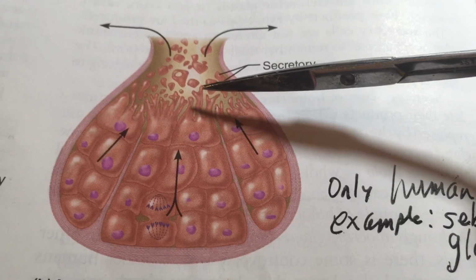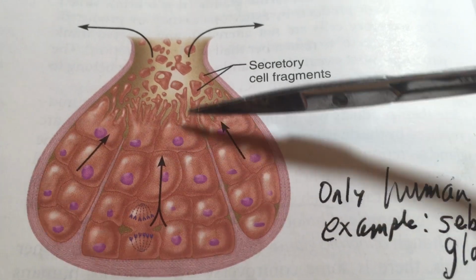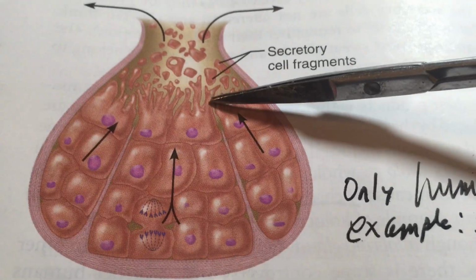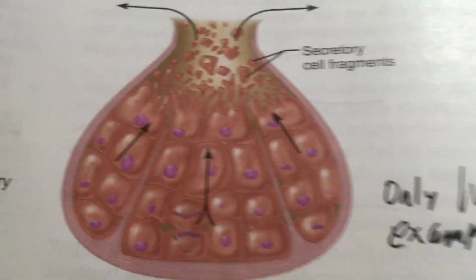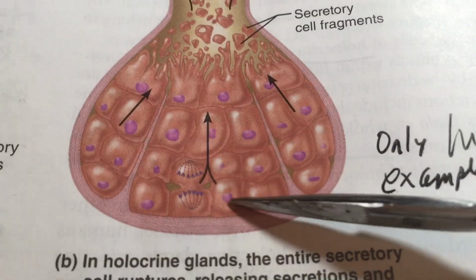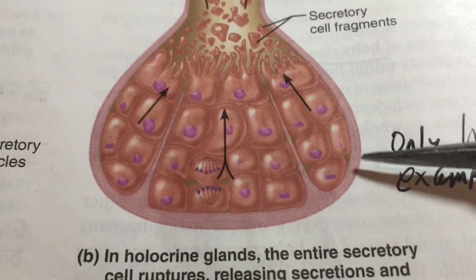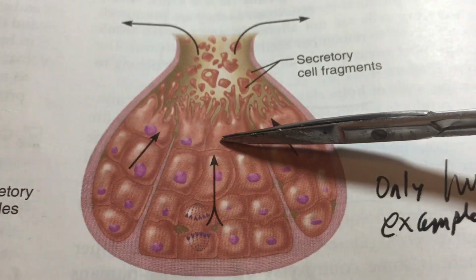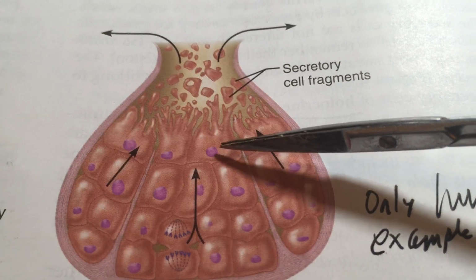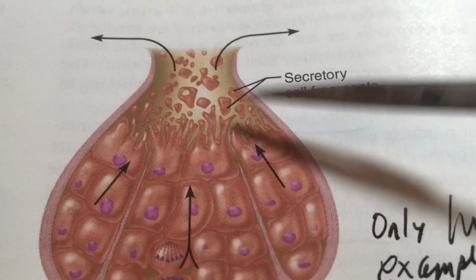The pores where the hairs are can be, when the hair is recycling its growth cycle and there's no hair in the particular follicle, but there's plenty of these sebaceous glands, then they might produce a little plug in that area, and the hair cell that's trying to grow gets sort of turned around a little bit. So that's the cause of whiteheads and blackheads. Okay, so you can see here we have rapid mitotic division. So we have these mitotic figures down here, and the cells are reproducing quickly because it's the entire cell that's being delivered when we think of delivery to the outside world.